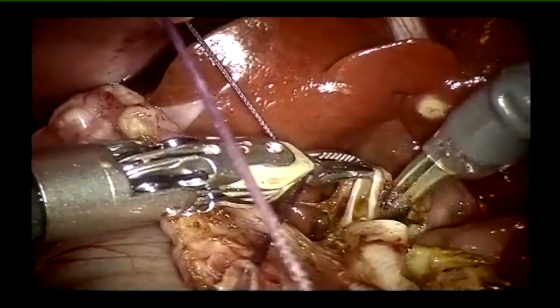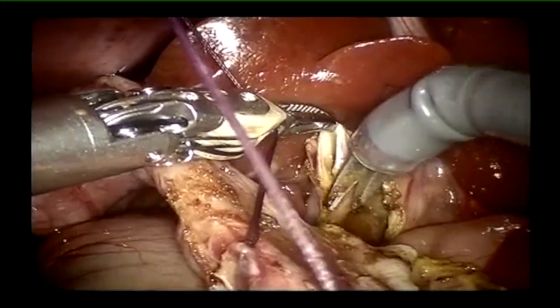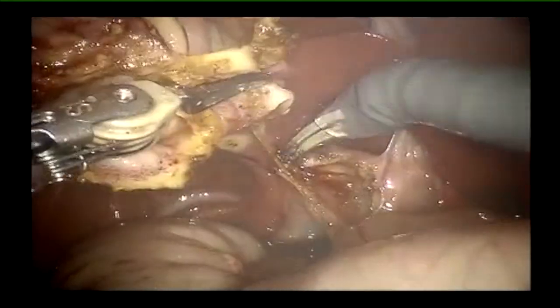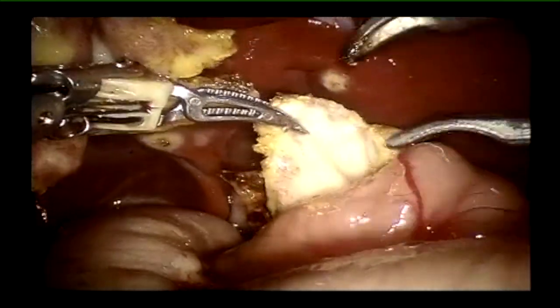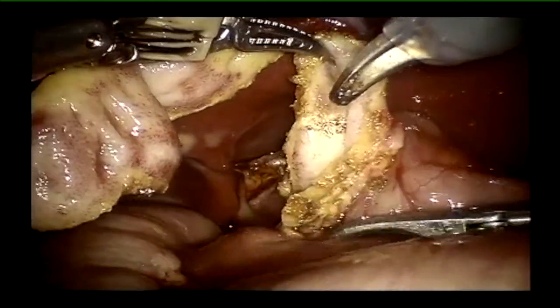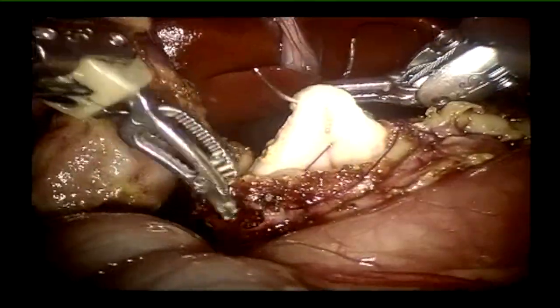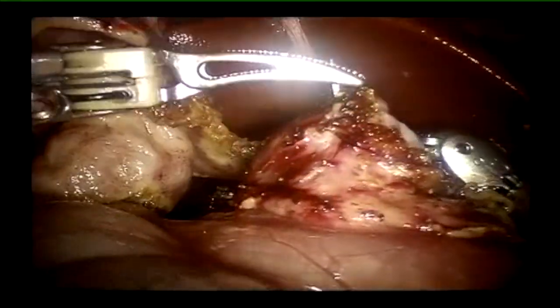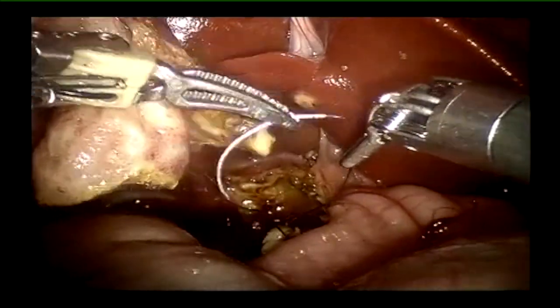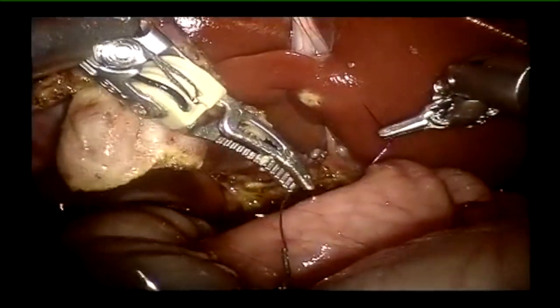Get your anatomical landmarks correct and perform a precise dissection. As you can see, this dissection has been nearly bloodless — if you stick to the right planes and know your anatomy, there won't be much bleeding. Here we are burning away the mucosa of the distal stump. We decided to close the stump because it was fairly wide and we couldn't locate the distal opening, so rather than risk a bile leak postoperatively, we closed it with a couple of running stitches.